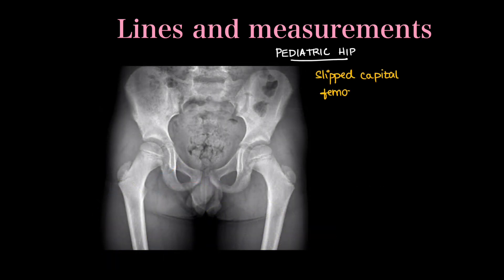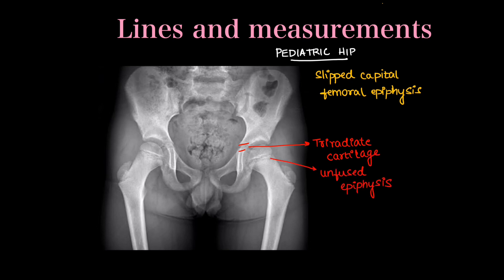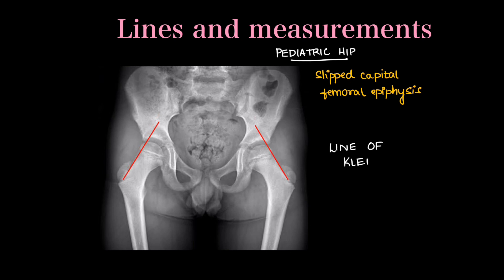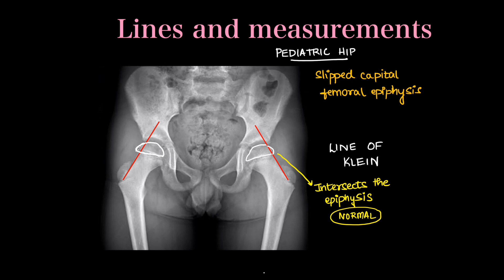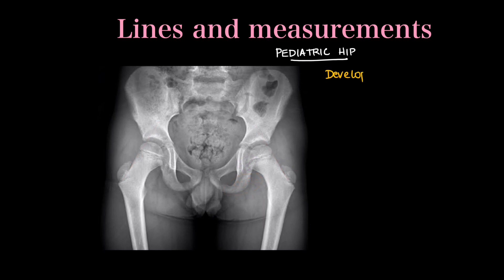Pediatric hip x-rays are identified by unfused tri-radiate cartilage and unfused epiphysis. In cases of suspected slipped capital femoral epiphysis, we draw Klein's line, drawn tangential to the lateral aspect of the femoral neck. Normally this line will intersect part of the epiphysis of the femoral bone. In cases of epiphyseal slip, there is no intersection of the line with the epiphysis.